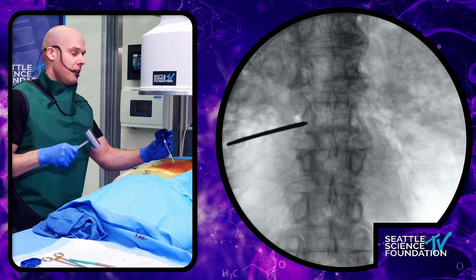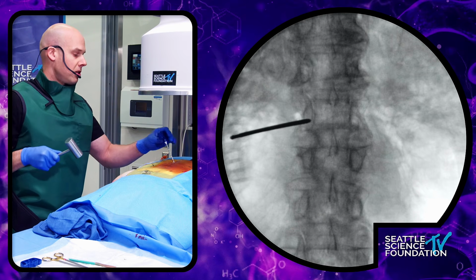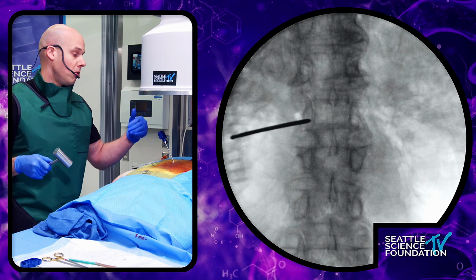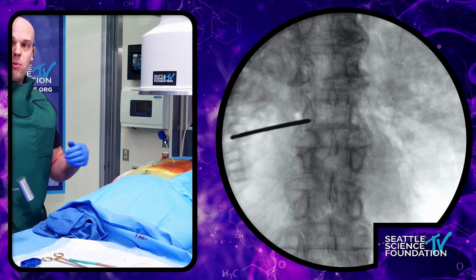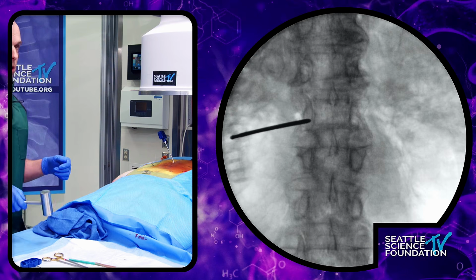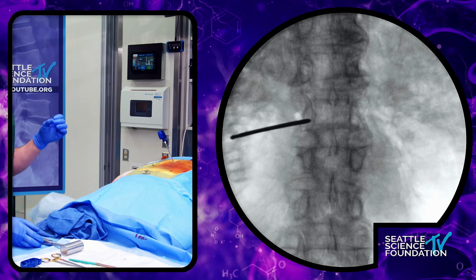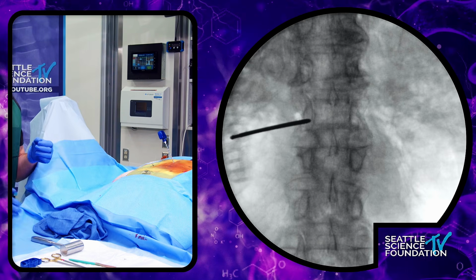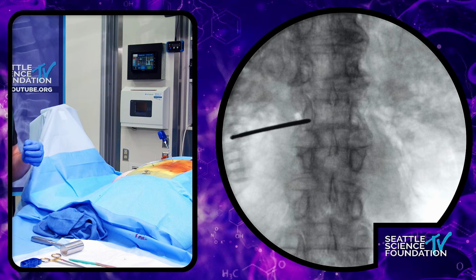And again, as we discussed a couple of times, we just don't want to breach the medial wall of the pedicle with a transpedicular approach, just like what we just demonstrated. So we'll go lateral here. We'll take a look at our depth. I used a bevel introducer, so especially for the transpedicular access, it is great because it provides more flexibility.